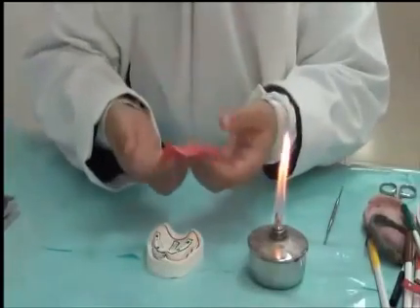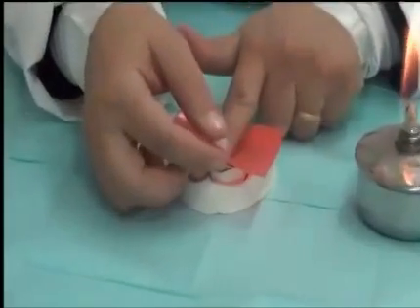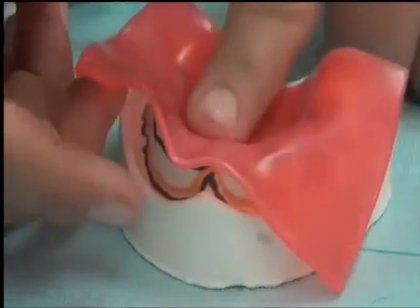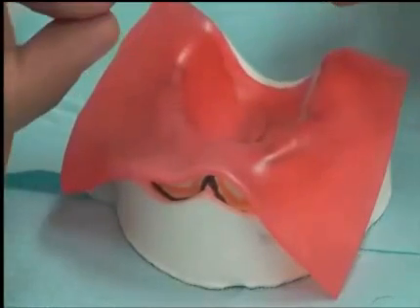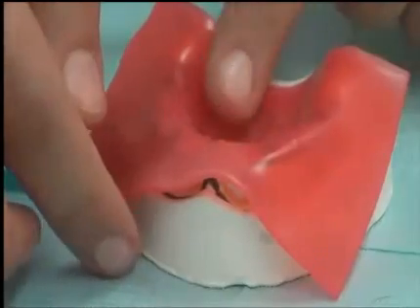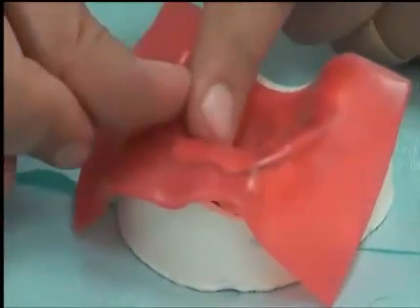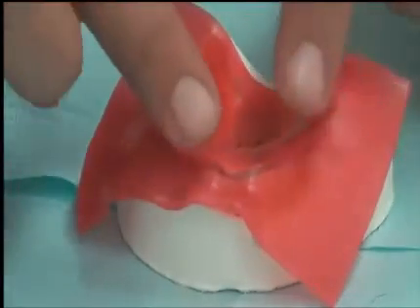And once it's soft enough, we just put it on the cast and begin adapting it. We usually adapt from the middle first. Adaptation doesn't mean pressing, it's simply shaping. I don't press firmly on the wax, because if I press more, this wax will become thinned out, and I lose the space that I need. So the adaptation means only shaping the wax into the shape of the cast. It's now fully adapted to the cast without any extra pressure. The even thickness of the wax is maintained all around.